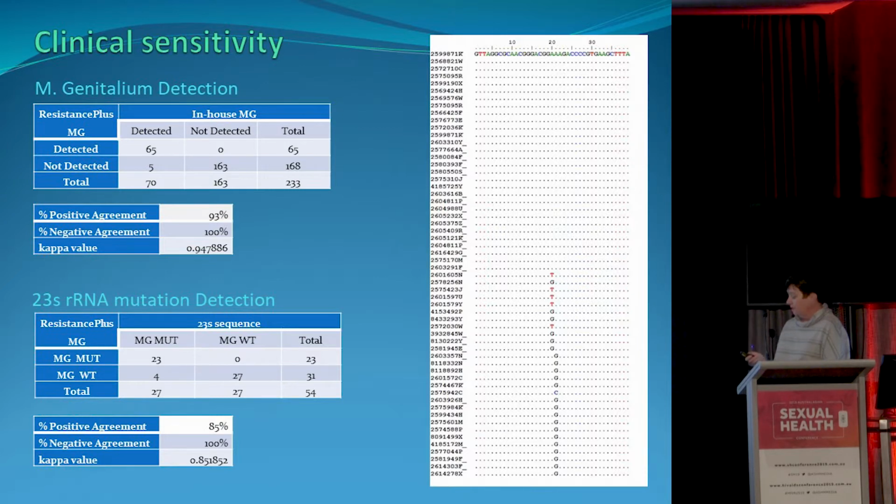MGen target there. And just for interest, of those positive isolates that we sequenced, we encountered 4 of those 5 common mutations in that snapshot of the population that we have in our client specimens.